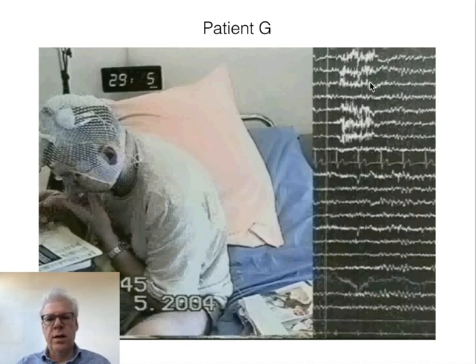Now, you're not experts in EEG yet, but there are some patterns I think that you can recognize. For instance, this is the EKG, the electrocardiogram. This is some muscle activity, and shown otherwise are the various rhythms of the brain recorded from several locations. Generally, those rhythms are in the 0.5 up to, say, 35 hertz frequency range. There are much higher frequencies in the brain, and in part they can be recorded at the scalp in slower frequencies, but for now this suffices.